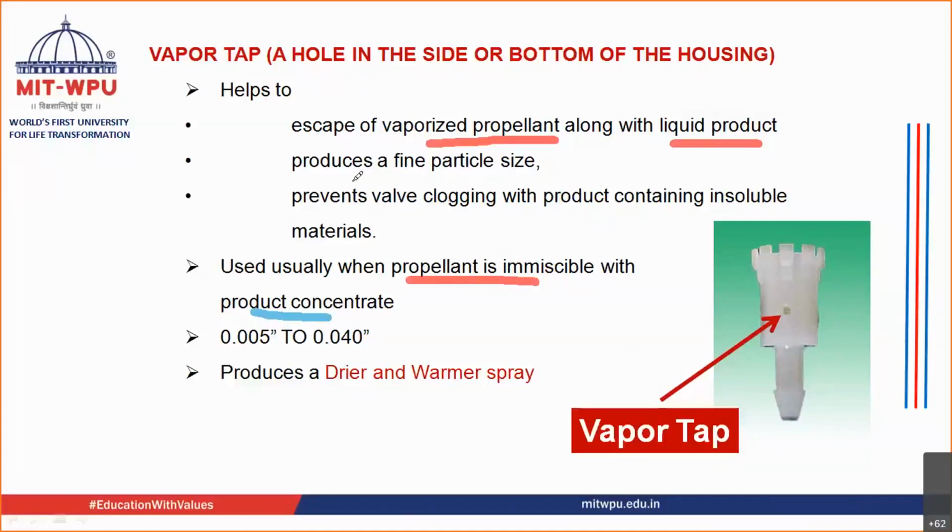It also helps to produce a very fine particle size, and it helps in preventing clogging of the valve when insoluble materials are present, that is, in suspension aerosols.